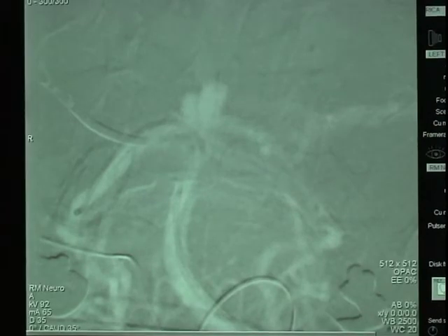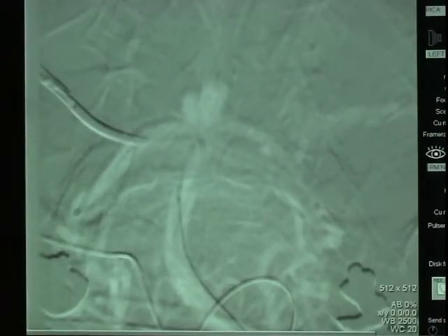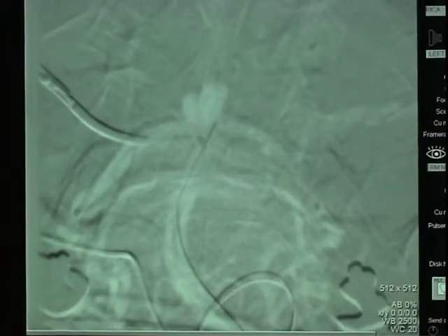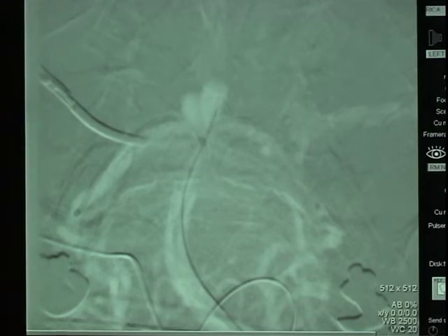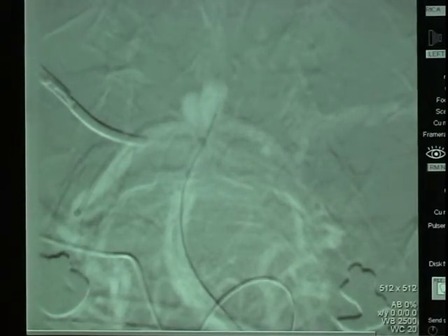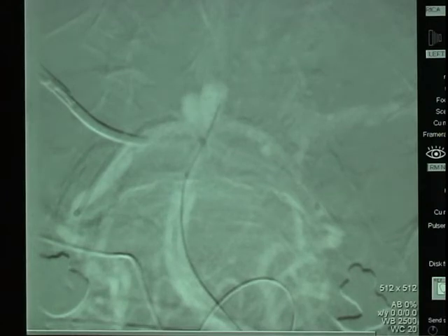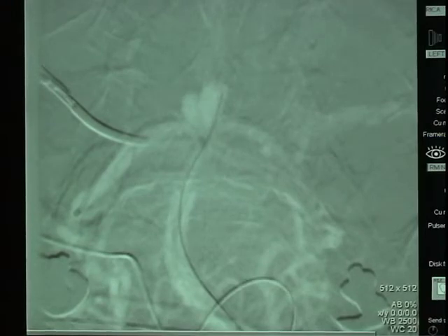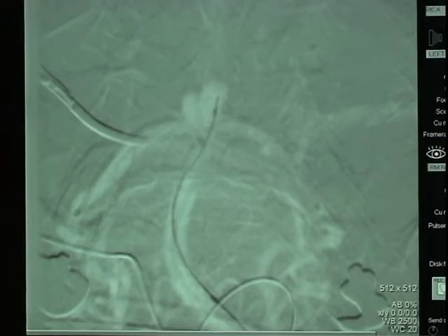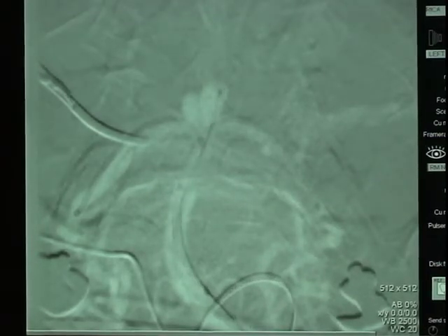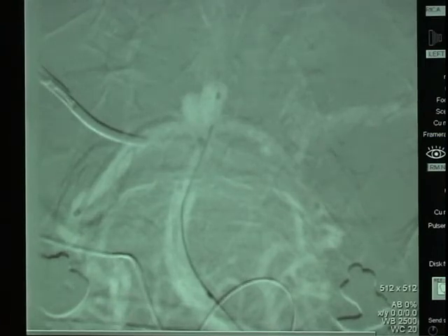We will now advance a third microcatheter — an Echelon 10 microcatheter over an Expedient 10 wire — into the aneurysm itself. The wire is placed into the fundus or body of the aneurysm and the catheter is gently advanced over the wire into the aneurysm. It is through this third catheter that we will deliver our platinum coils. The delivery wire is removed and the catheter is positioned within the aneurysm.